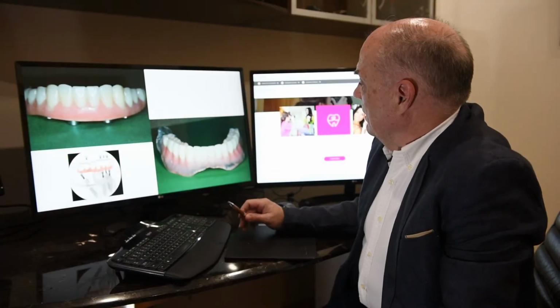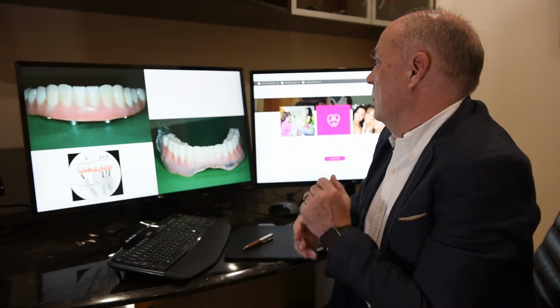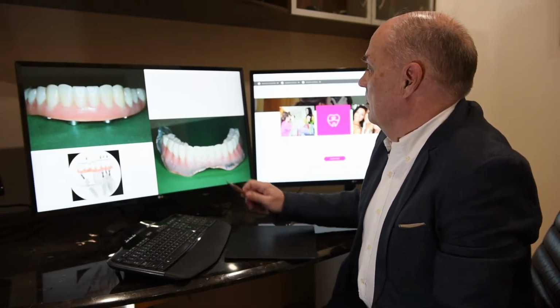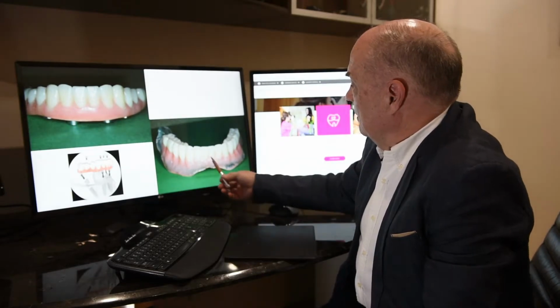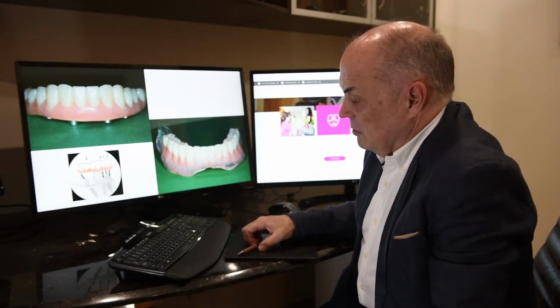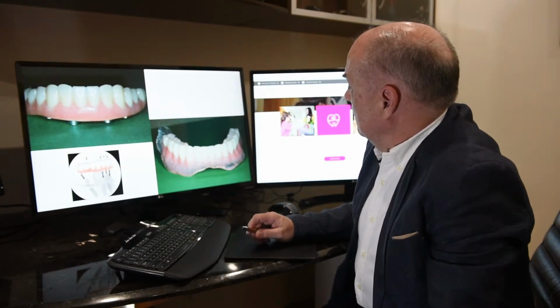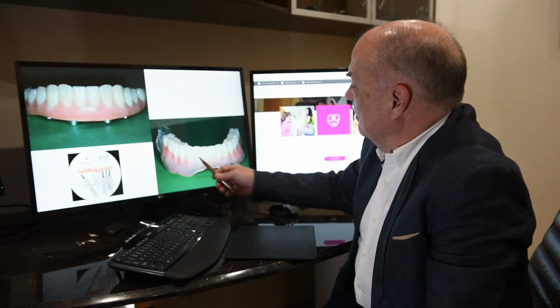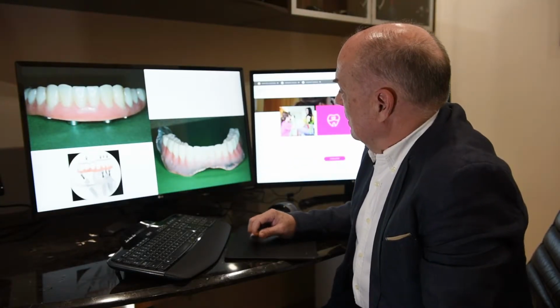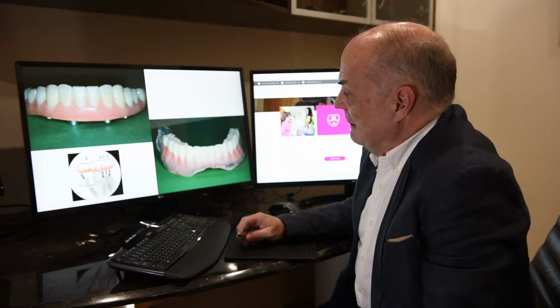Here on the lower right-hand screen is just the same thing as the complete removable denture. Just high-quality denture teeth, high-quality resin, a well-made, conventional denture. Now this particular denture is what we call a suction denture. It's invented by a Japanese chap, Hiro Abe, and it's just a modified impression technique which sometimes gets you very good suction. But again, the teeth are the same, the resin's the same. With the all-on-4 it's bolted down.